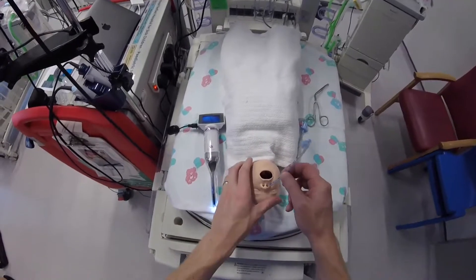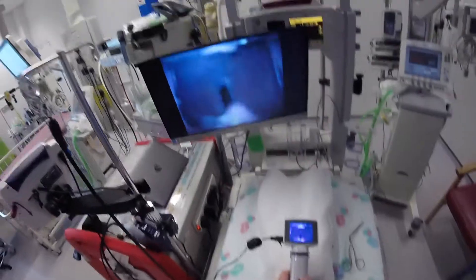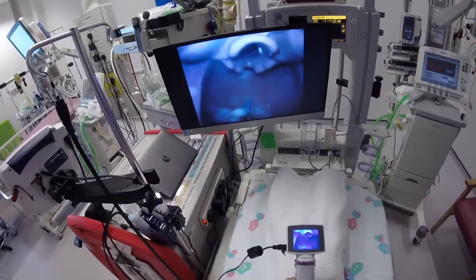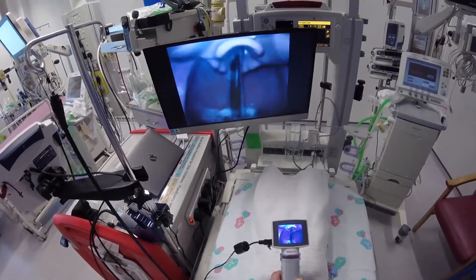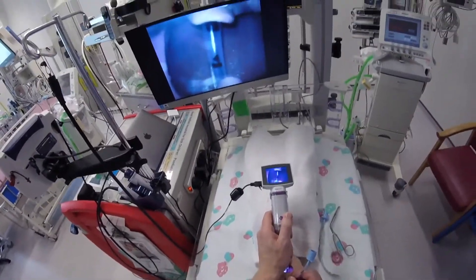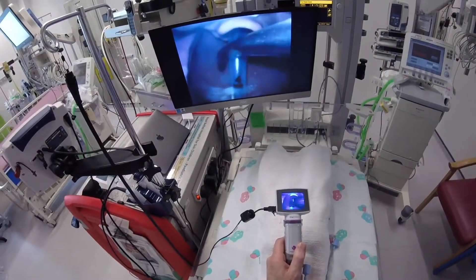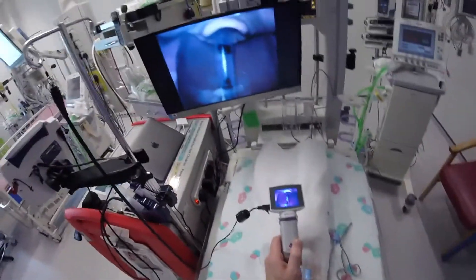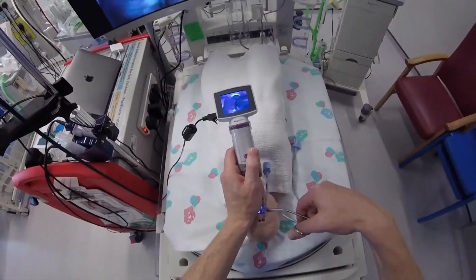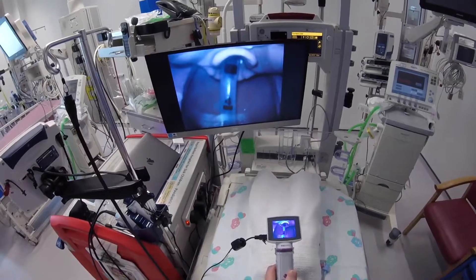Nasal intubation is also fairly straightforward with this. We drop the tube down the back of the nose, reach in, grab hold of the tube, lift it up, and pass it through the cords. I have no difficulty with that. With some other hyper-angulated blades it can be quite difficult and you have to split it into two movements, but with this I don't have to alter my view — I've got the view at the back of the throat, reach in, pick up the tube, and do it all with one view.